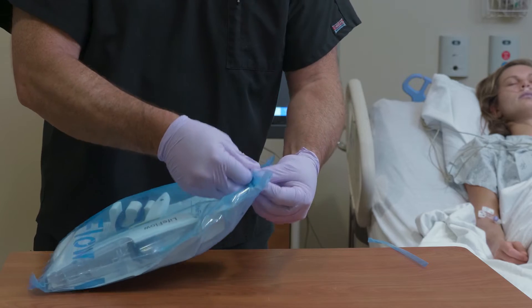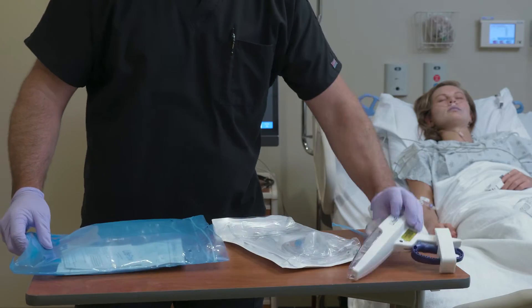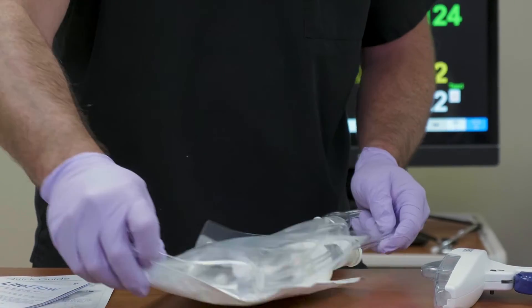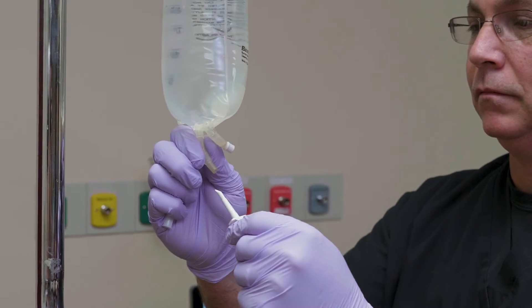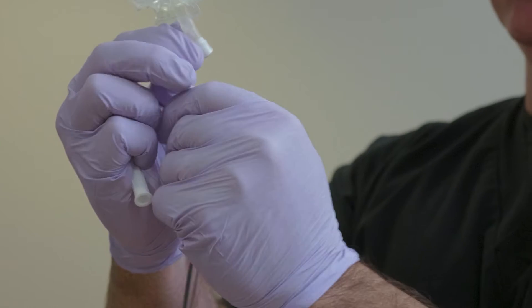The first step is to open the bag, then remove the sterile pouch and the handle. Next, open the sterile pouch and remove the tubing and the paper band. Remove the cap from the sterile spike and insert into the fluid bag using standard aseptic technique.